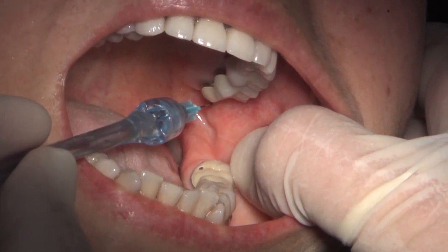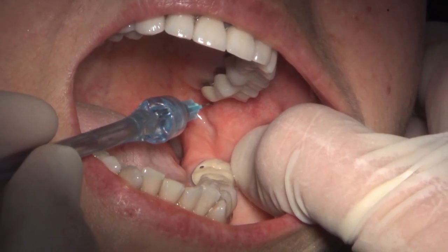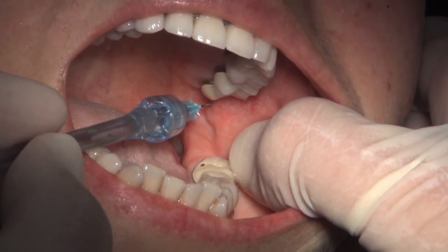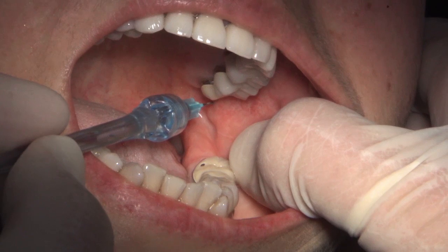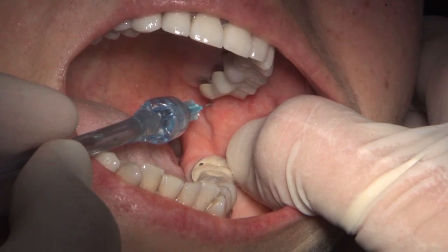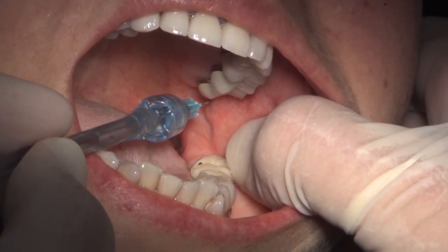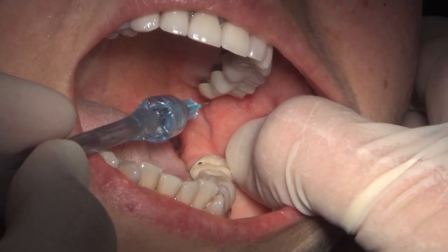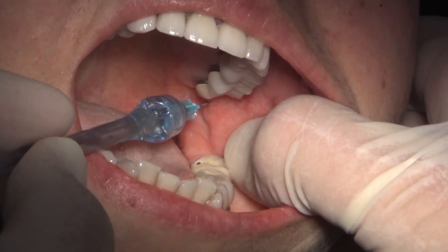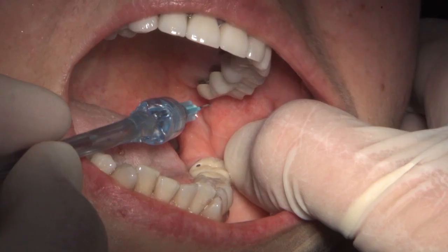That's one of the nice things — from this view you can't see it, but you're clear right from the attachment through the entire thing. So if you have any positive aspiration, it's really easy to pick up on the wand. Well, I'm really happy I got a positive aspiration on my first one — with you here, and just to see how to handle it well while you're there. So typically for a Gow-Gates, once we're in here and expressing at the normal speed, will you do a full cartridge? We do a full cartridge.